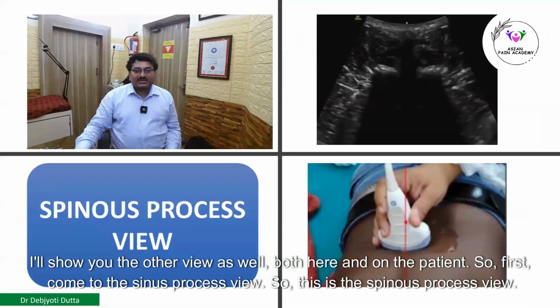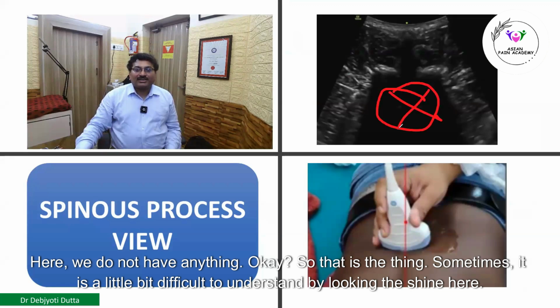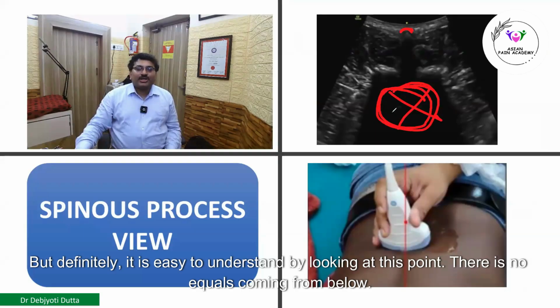So first come to the spinous process view. This is the spinous process view. So I think you can distinctly differentiate the spinous process view from the interspinous view by looking at this area. Here we do not have anything. Sometimes it is a little bit difficult to understand by looking at the shine here, but definitely it is easy to understand by looking at this point. There are no echoes coming from below.